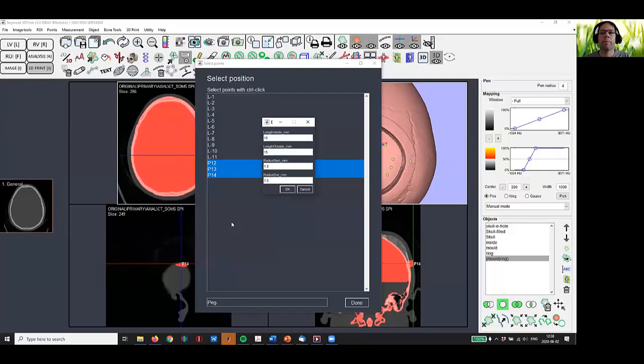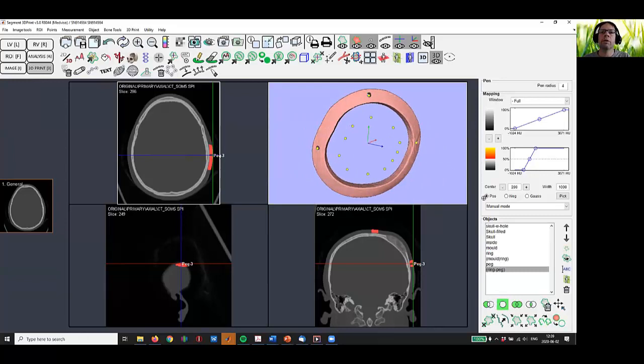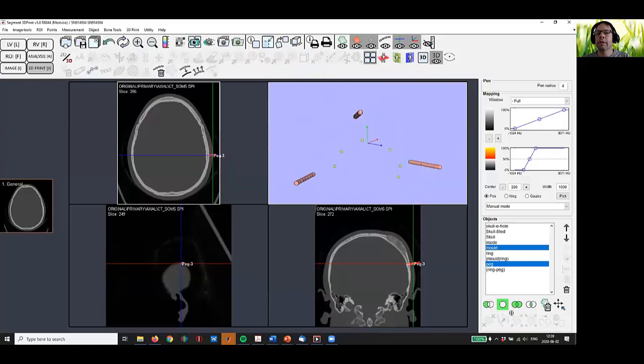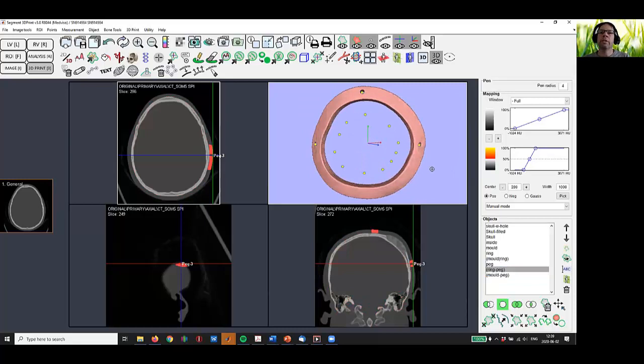So we got a new part that we can then subtract from the ring. So we get holes in the ring. And we can actually also subtract that from the mold. So we can see how the ring will fit on the mold then. So what we will export to the neuronavigation is the standard CT, and then we put this on top so we can import it to the neuronavigation system. And then the surgeon can put the marker here and here, and then rotate this ring until it fits compared to what we expected on the plan.